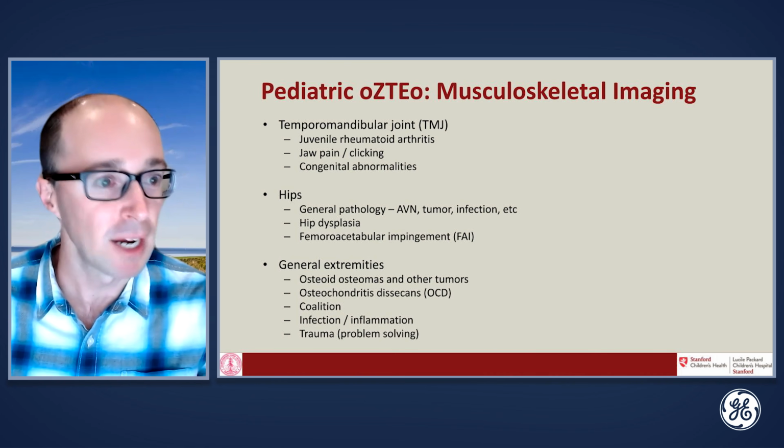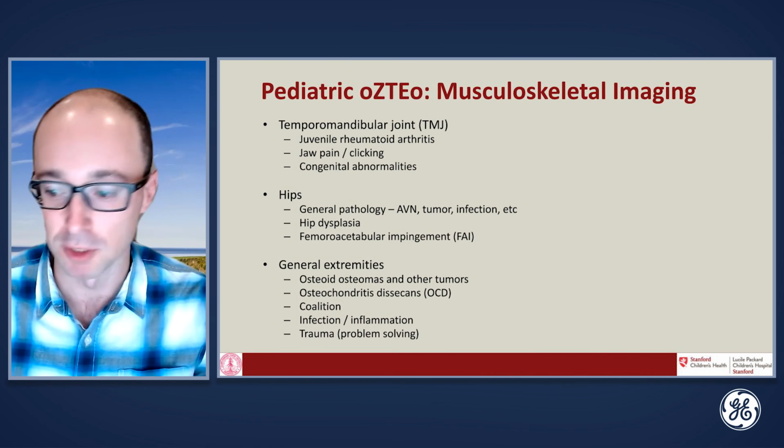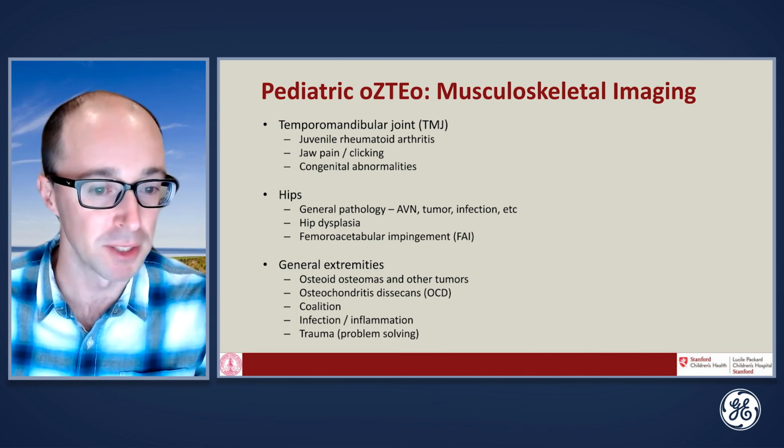So what are the actual applications? We found it to be very helpful in temporomandibular joint imaging, in particular in juvenile rheumatoid arthritis evaluation.